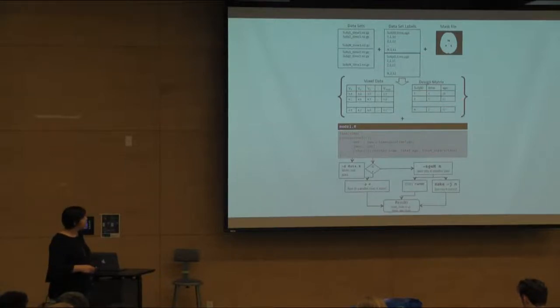And then what you provide is this process voxel function in a piece of code that is called something like model.r. What this does is it loads that library that we're so familiar with, NLME, and it runs this model using V as your voxel, so that's your brain basically. I actually skipped a step. Often I think it comes from a different matrix, so there should probably be one line in here, but I'll go over that. Your brain is a function of time, age, and the interaction of the two.